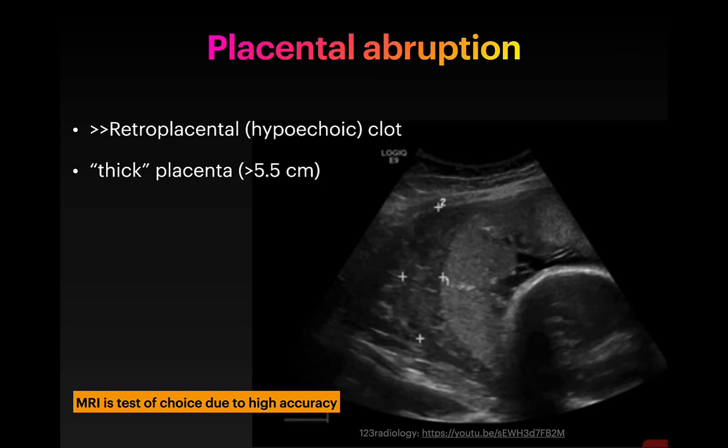This is usually not an emergent finding, but it may be helpful for you to notice what it is if you have a clinical picture that's pushing you this way. I'm not recommending that you make this diagnosis by point of care ultrasound, which is pretty much always the answer if MRI is the test of choice. But if you see these blobs in the uterus while you're looking at something, it might be useful for you when you put it together with the clinical picture.